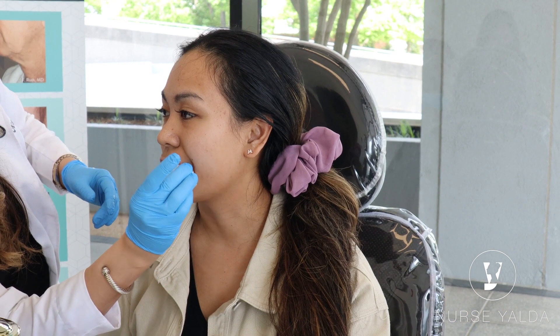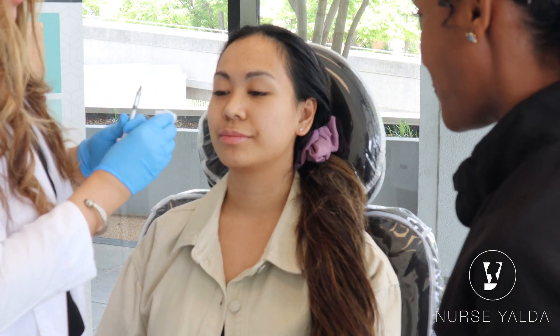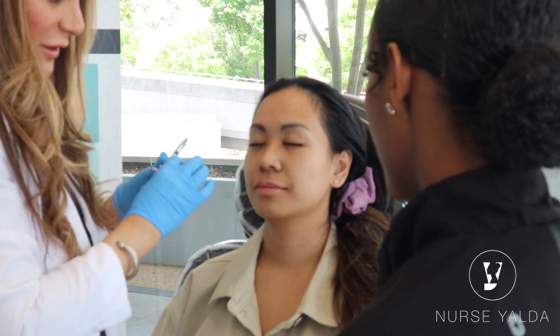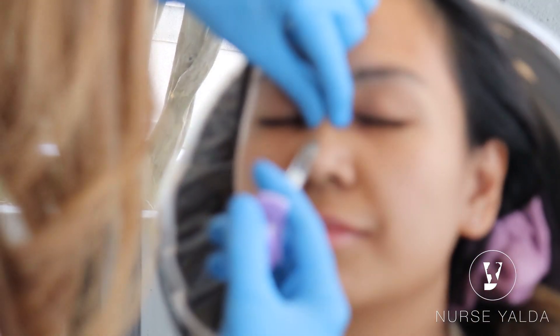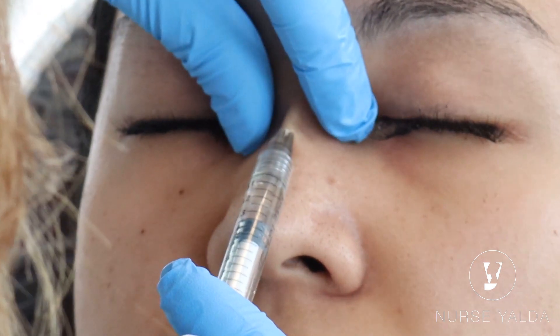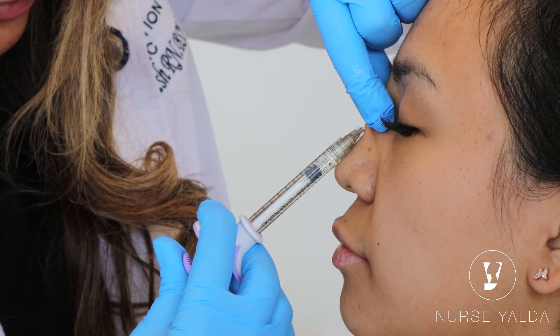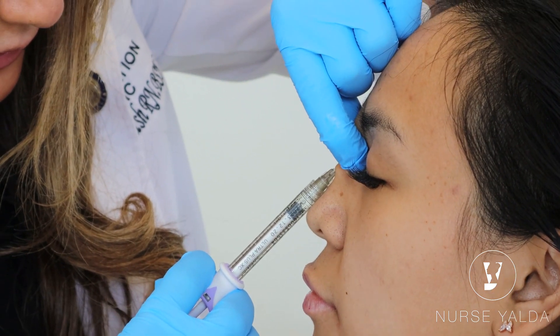Oh my god, that is gorgeous! This is something you want to do only after you're very comfortable, because of where the artery goes and provides blood circulation to that area. This is going to give her a non-surgical rhinoplasty — some bridge. With the bridge, I lift up the tissue, go up, wait a little bit. Because it's immediate, she's going to love it so much.